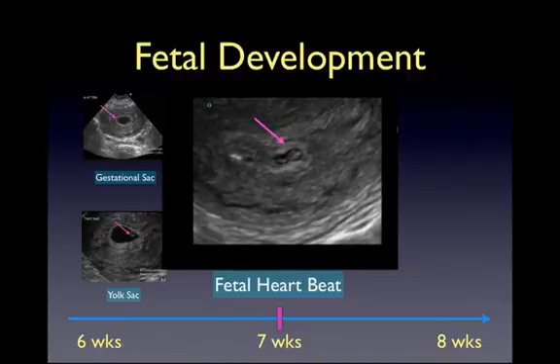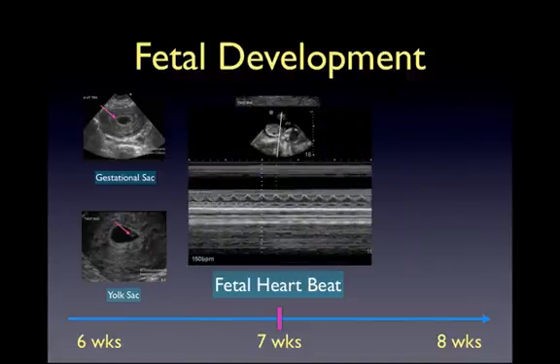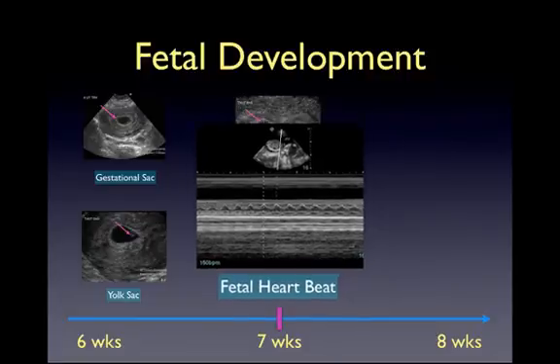The fetal heart rate can be measured on M mode. In this image, the fetal heart rate is measured to be 150 beats per minute. Spectral Doppler should not be used, as this use carries a theoretical risk of exposing the fetus to higher energy levels.